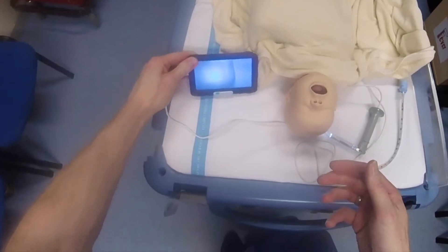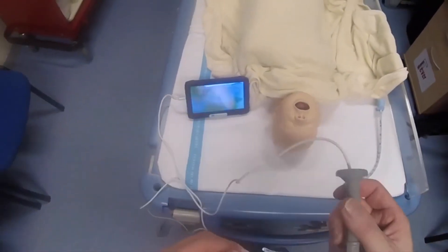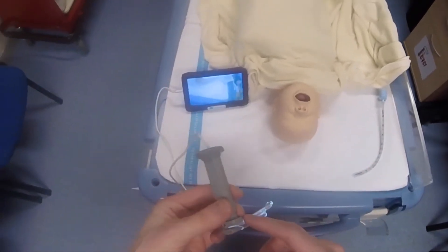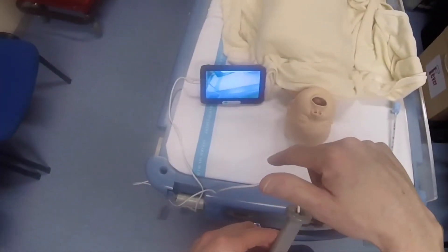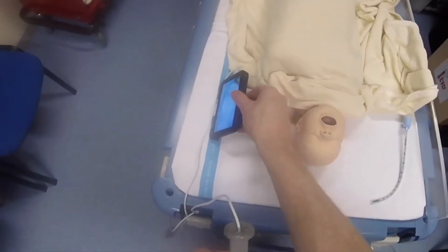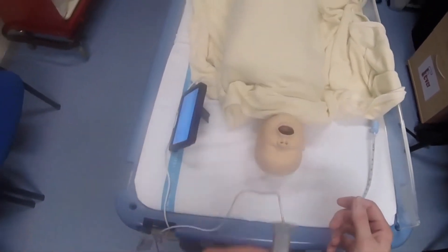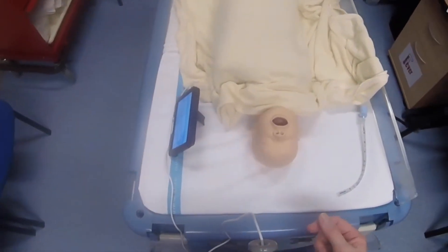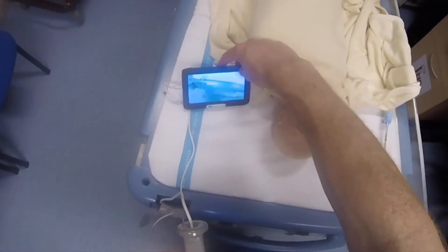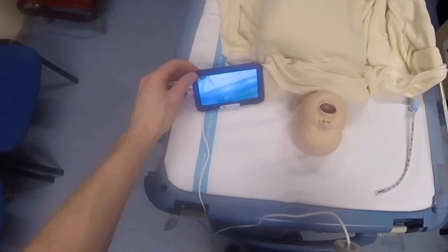Let's have a look and see how this performs for doing an intubation. One of the nice things is the classical Miller blade design, and the fact that the screen is connected by a long cable means you can actually blind the intubator to the screen — they can do the intubation with direct vision, while the instructor watches the screen and gives advice or tips if needed. It can also obviously be used as a video laryngoscope as well.